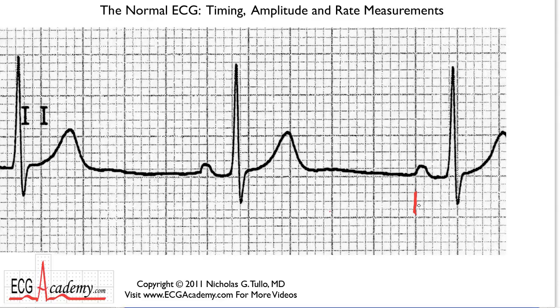But there is an easier way. If it's 200 milliseconds, 60,000 divided by 200 is equal to 300. And then what about 400 milliseconds? Well, if you take 60,000 divided by 400, that comes out to be 150. Now there's a sequence of numbers, and as long as you can memorize these numbers, then it becomes very easy to count the rate. Okay, and so here are the numbers.